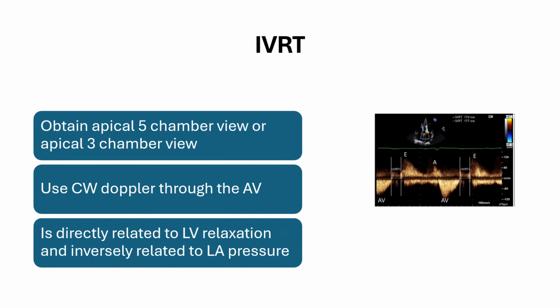This measurement, or IVRT measurement, is directly related to LV relaxation and inversely related to left atrial pressure. Please pause this video if you need more time to review this concept.